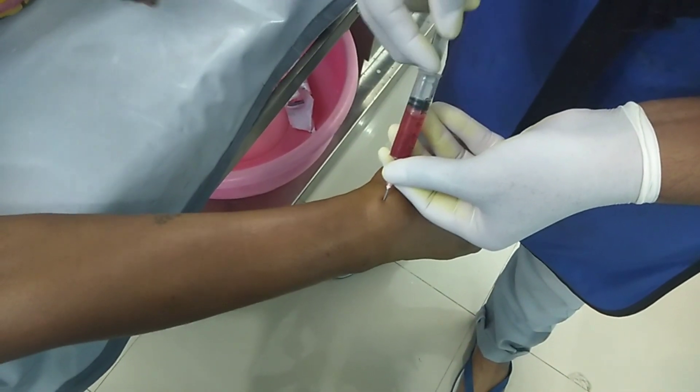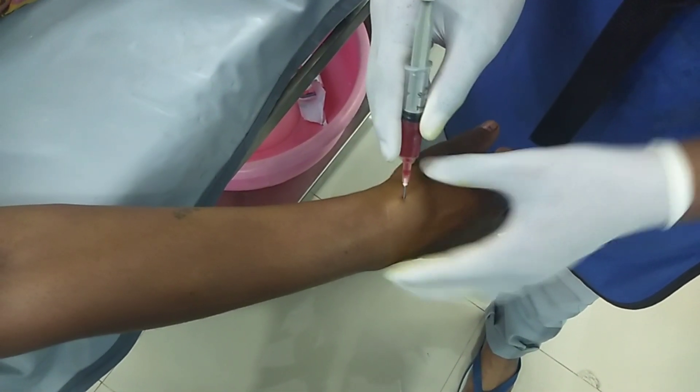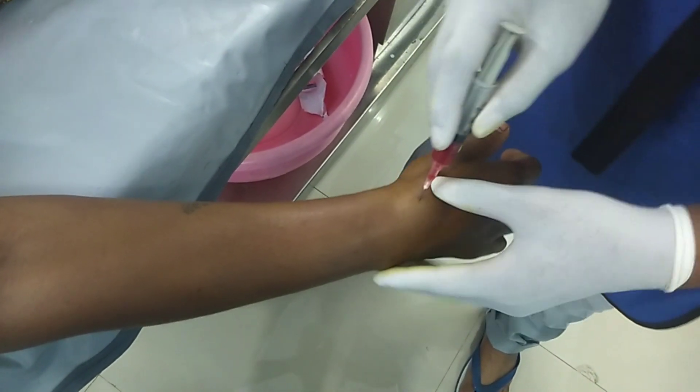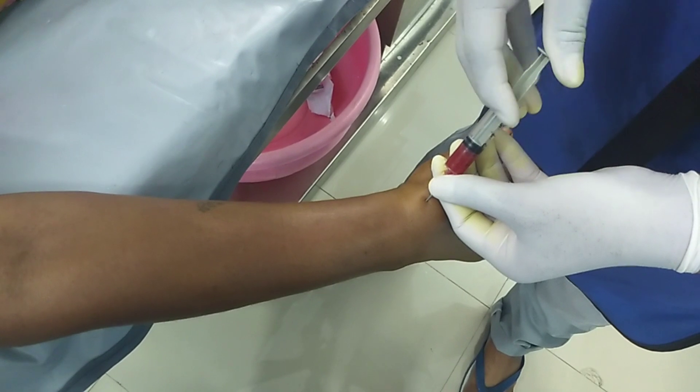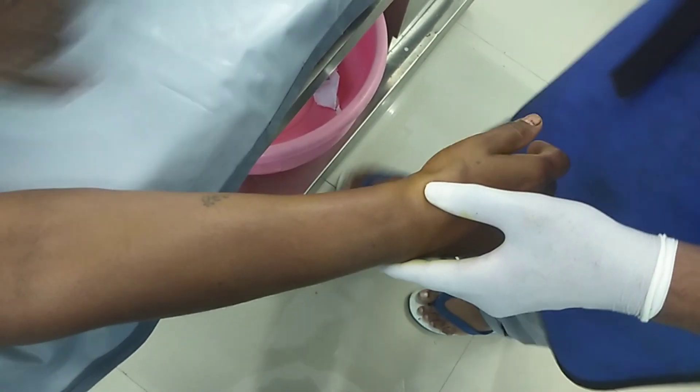Just withdraw a bit and reinsert the syringe over the surrounding area. After injecting 4 to 5 ml of xylocaine, we have now got a good pain-free wrist joint.